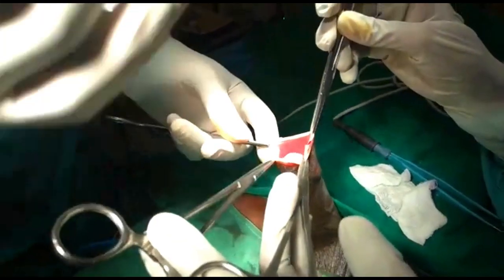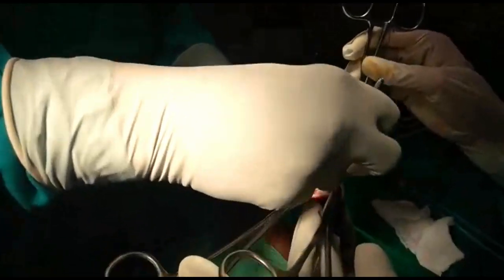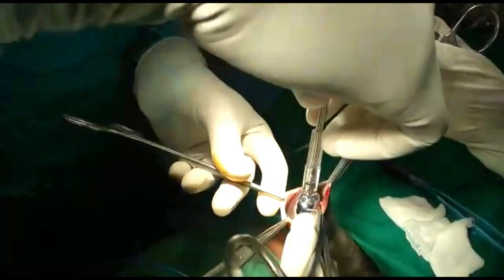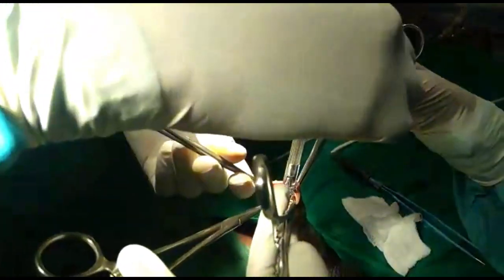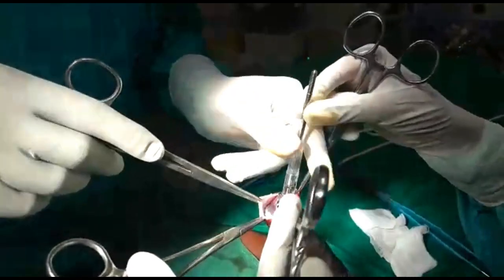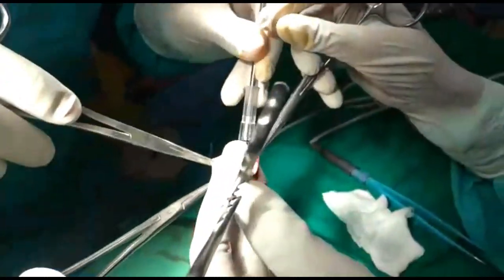This is the stapler circumcision device. It contains a plastibel. The plastibel is actually going to go inside and protect the glans against any injury. The plastibel has to be held at an angle like this. You can see that the plastibel is quite short.